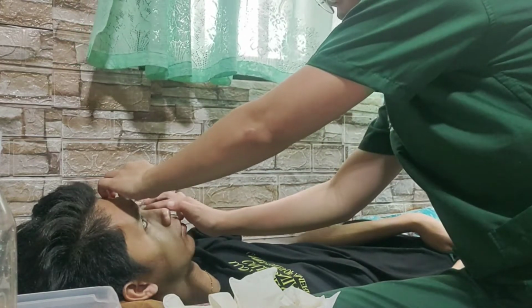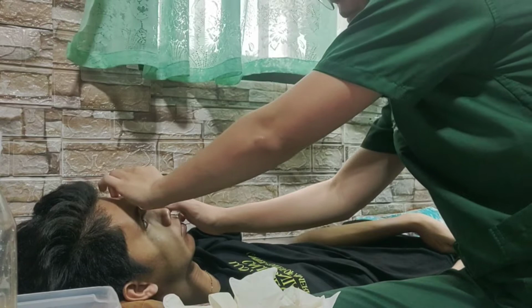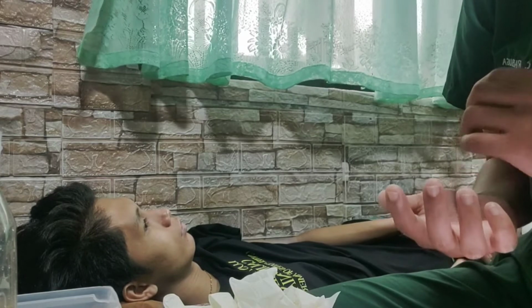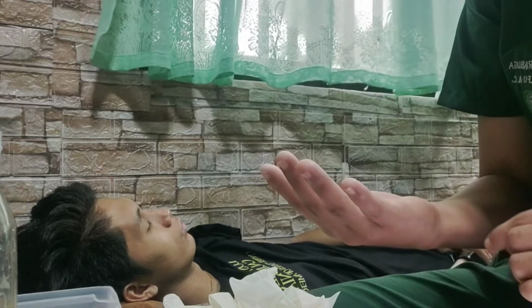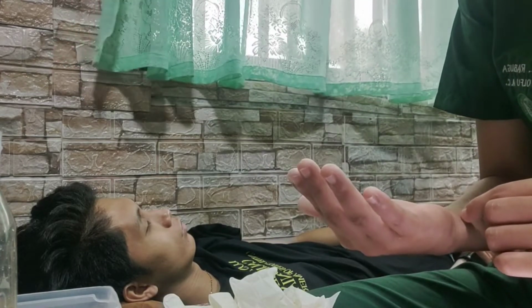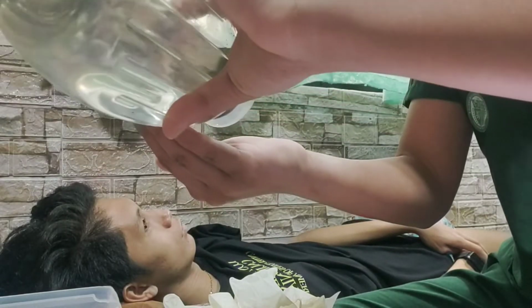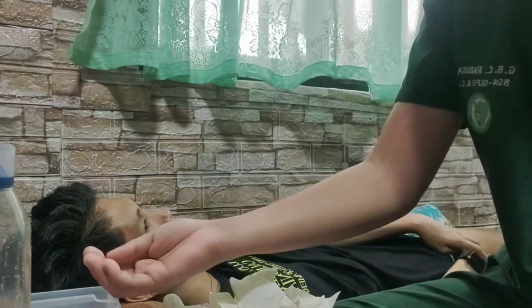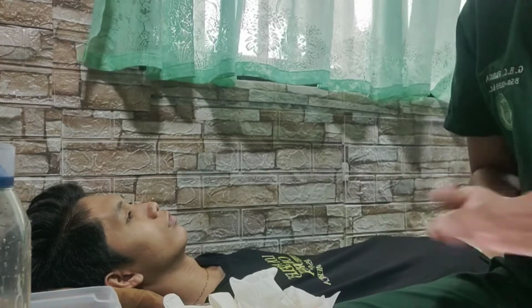Pinch with thumb and index finger. Then, away from the eye. Okay, thank you, sir. And next, with the contact lens in your palm, put a few drops of hydrogen peroxide to clean and disinfect the contact lens and put it in a proper container. Let's assume this is a hydrogen peroxide. So lastly, wash hands and document the procedure.